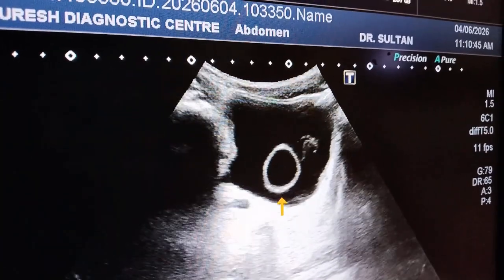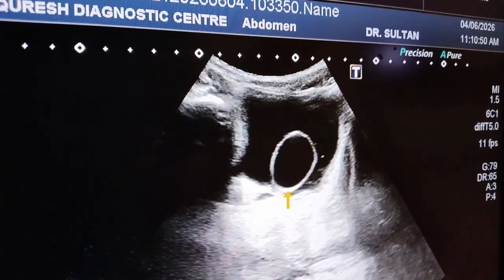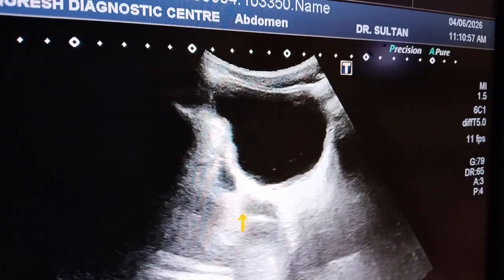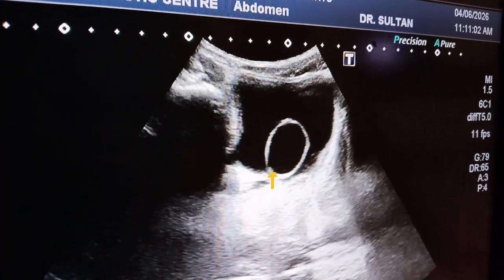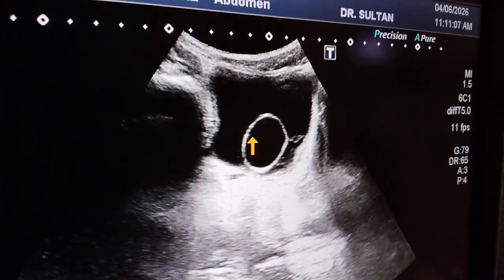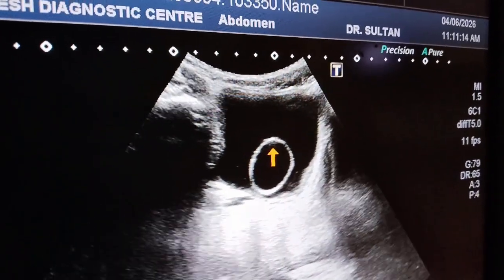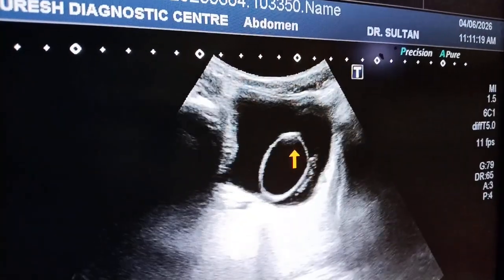So this obstructs the urine outflow into the urinary bladder, and then this appears as this. Due to the partial obstruction, gradually the ballooning of the distal ureter or intravesical part of the ureter is dilated. Gradually, it goes on increasing in size with the passage of time and with advancing age.